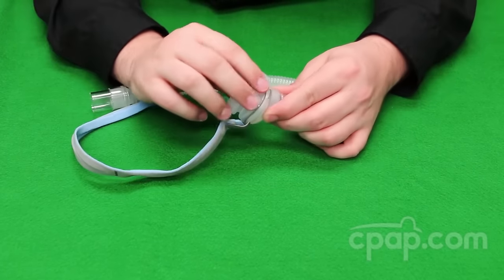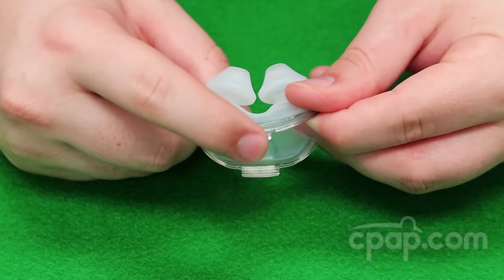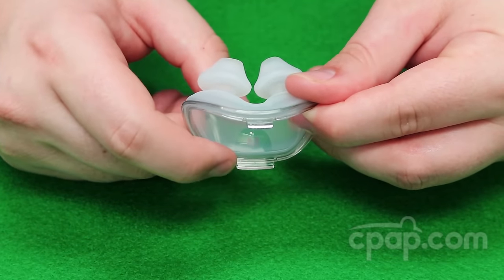To remove the pillow, the base should be flexed which will release the pillow clips from the vent frame. You will notice that the lower clip is larger than the upper clip. This will help when reinstalling.